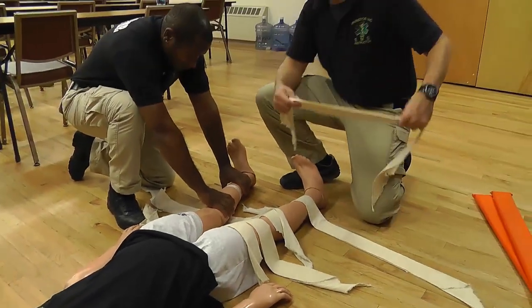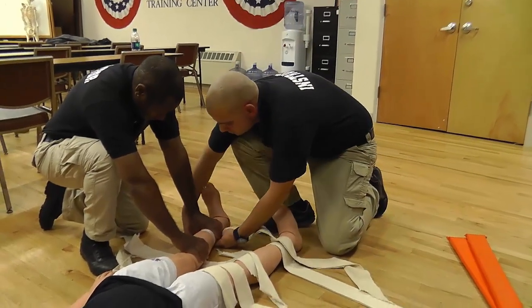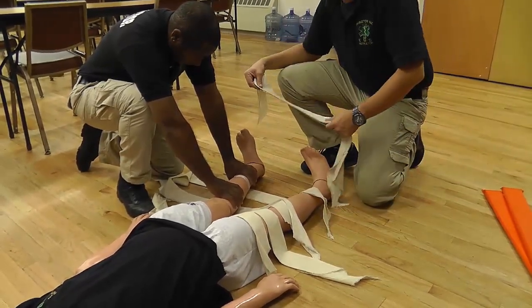I'm going to take another cravat and use the natural void below the ankle to position it properly. Finally, I'm going to take my fifth cravat and place it at the heel of the patient.